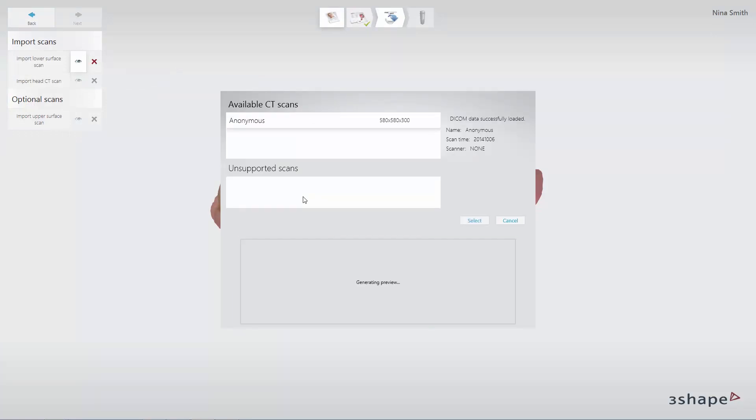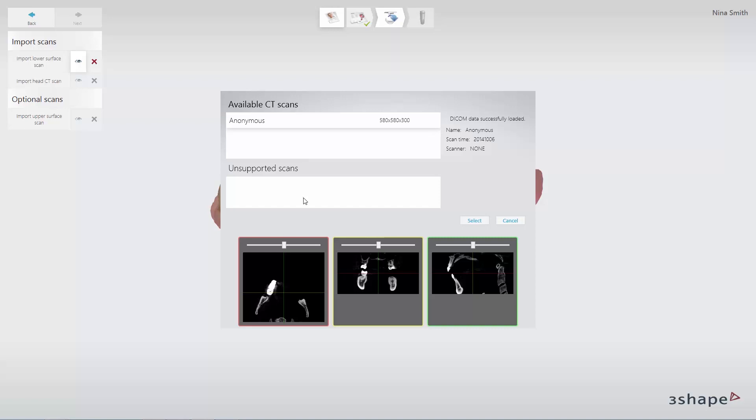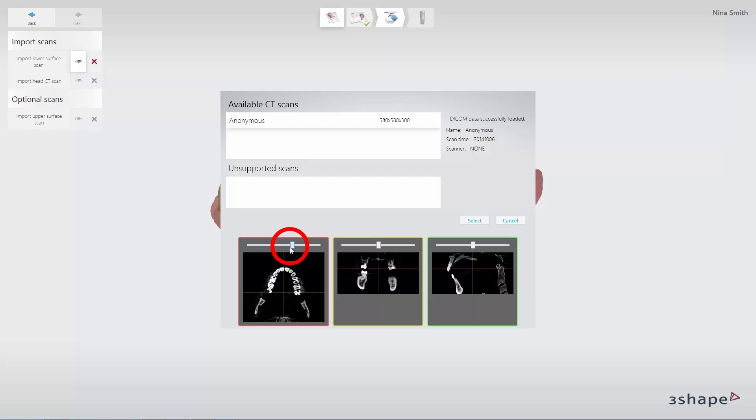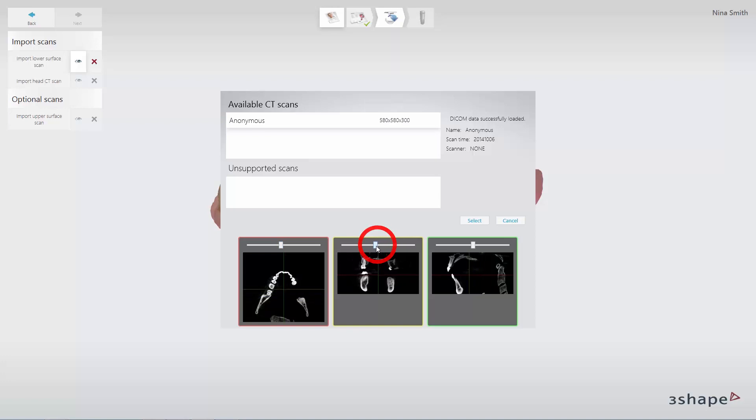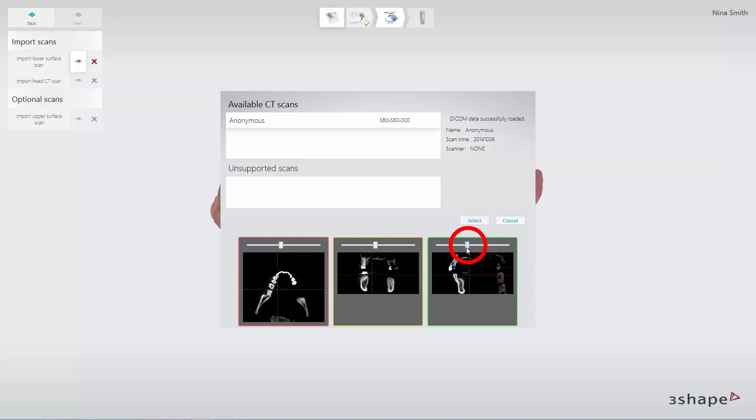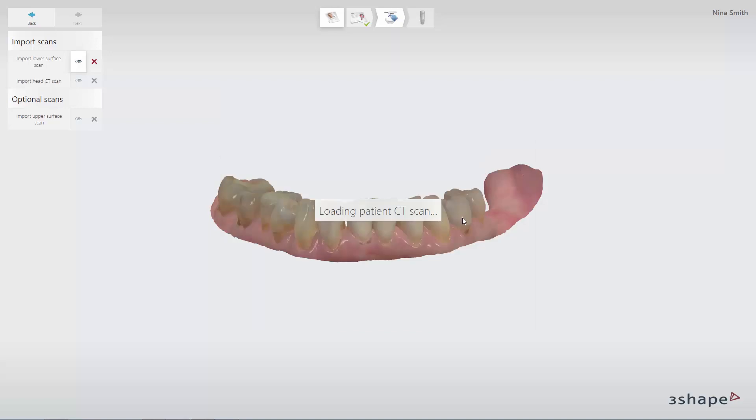The CT scan preview window will appear. Here you can preview the CT scan in the different views. Click Select to finalize the loading of the scan.